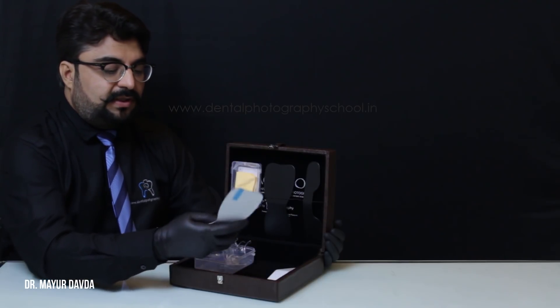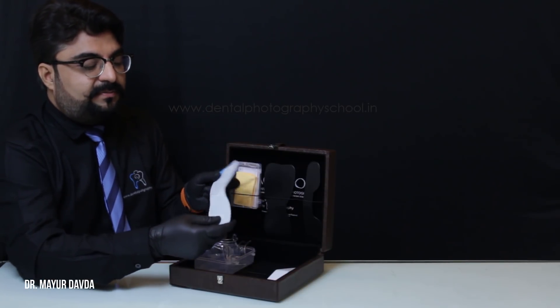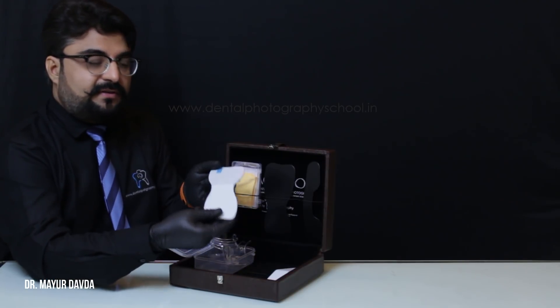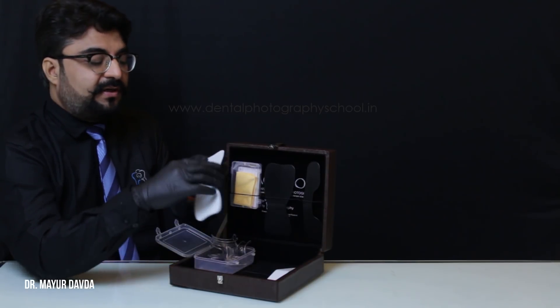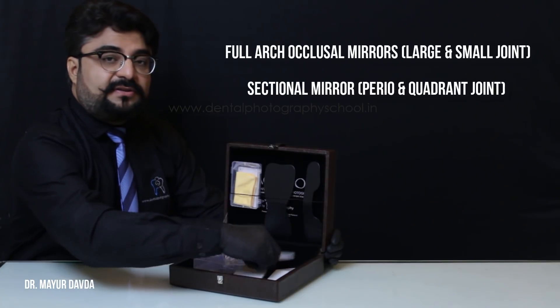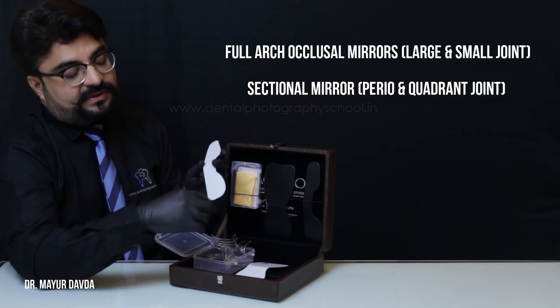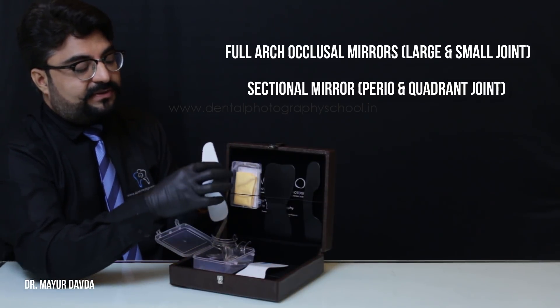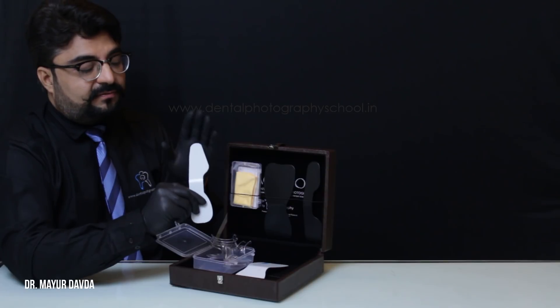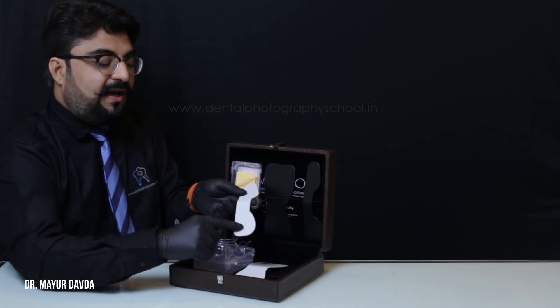We have stainless steel rigid heavy duty mirrors in a large size and a small size. Make sure that before you autoclave, you peel the stickers and then autoclave. We've put stickers on so that it does not get scratches. This is the full arch occlusal mirror, then you get a sectional mirror — this is the periodontal part and this is the quadrant part. I use this mirror 90 to 95 percent of the time.